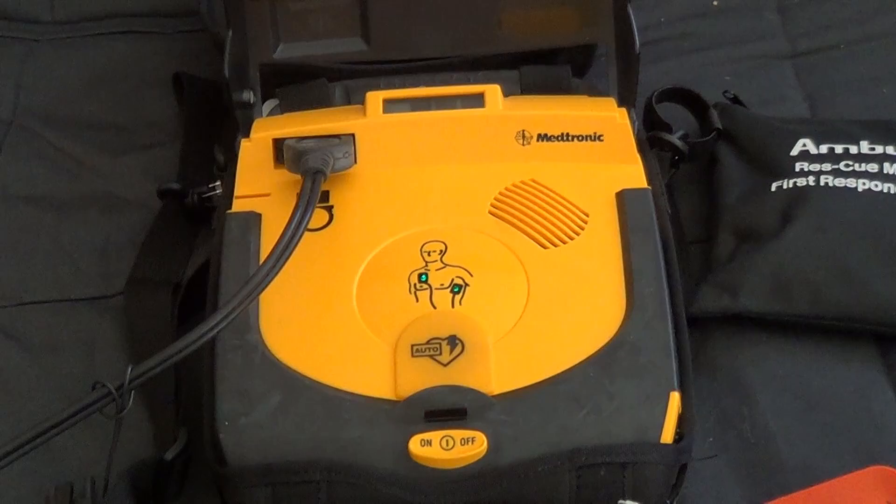Everyone clear. Do not touch patient. Delivering shock. Shock delivered.